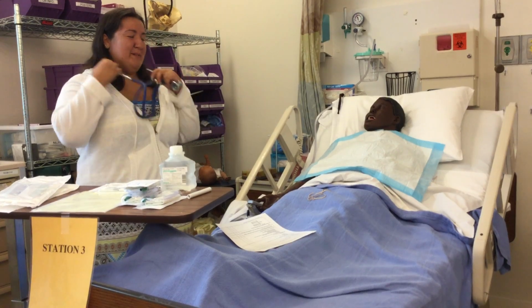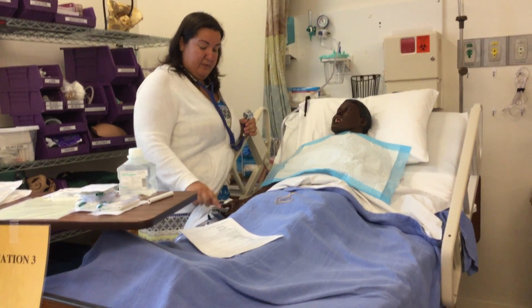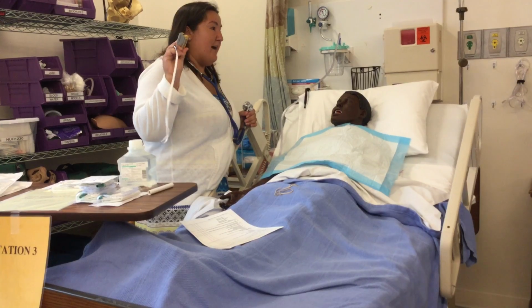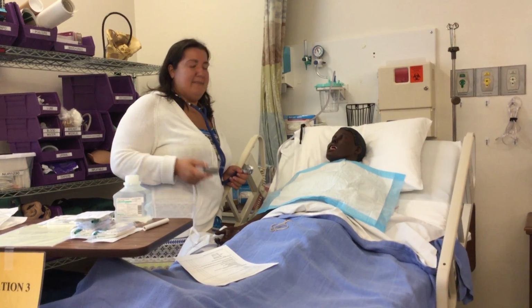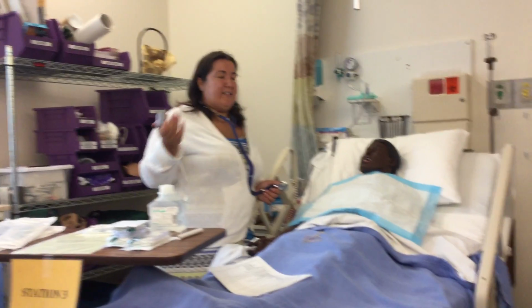That doesn't make any sense, but so we're going to listen to your patient. Then you also want to check their pulse ox. Usually you'll see that start to come lower. You're going to start to see that drop because they're not getting good oxygenation. You might see it go lower than where they've been, 95, 96. Now all of a sudden they're in the low 90s, the high 80s, because they're not oxygenating well.